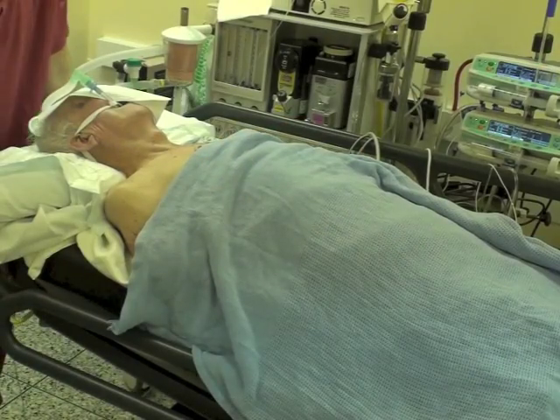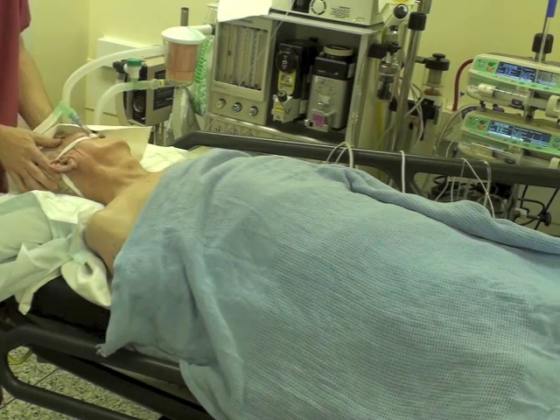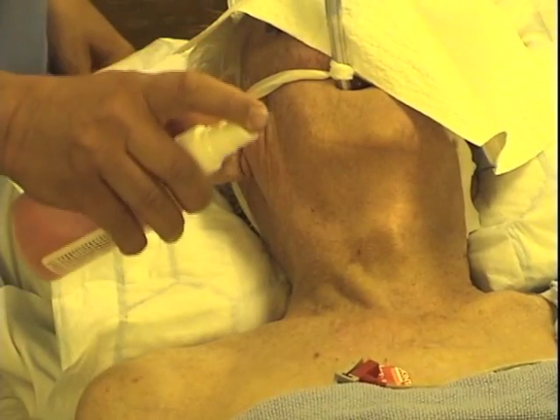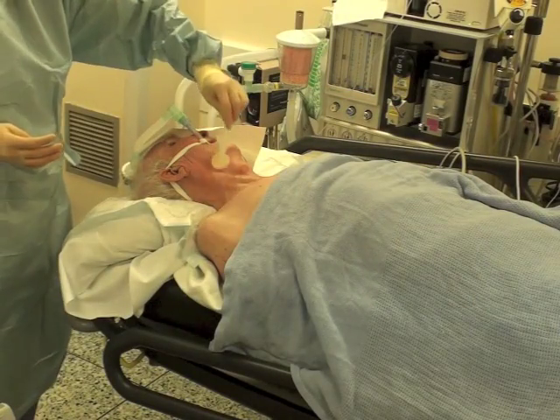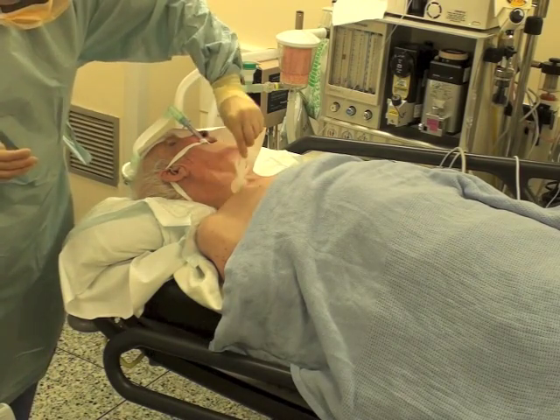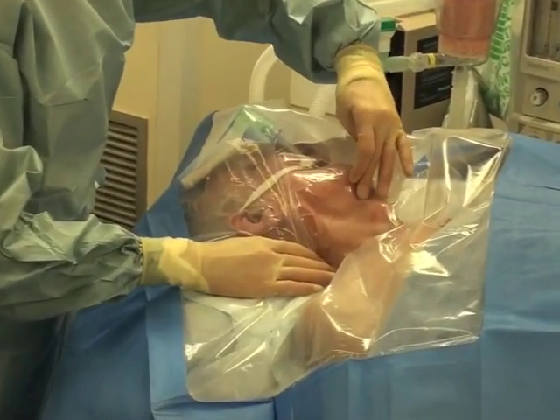Prepare the patient by placing the bed in a 15-30 degree Trendelenburg position to decrease the risk of air embolism. Turn the patient's head opposite to the procedure side. Prepare the area by scrubbing or spraying with chlorhexidine for more than 30 seconds. Let it dry and drape the site, making sure to include all landmarks within the sterile field.